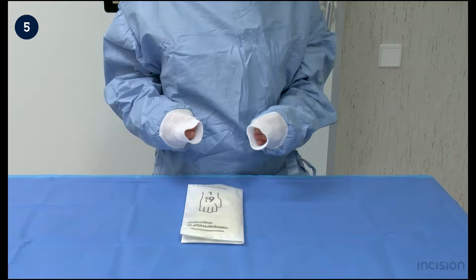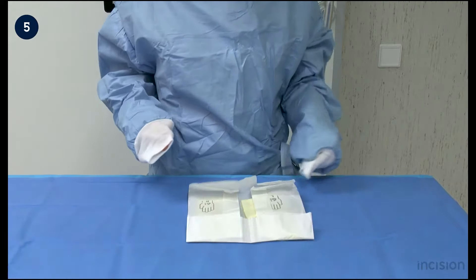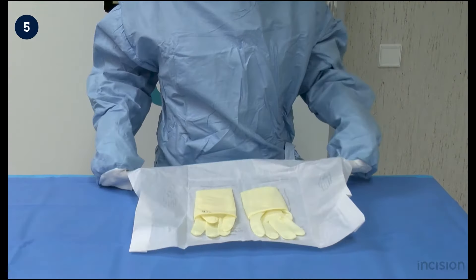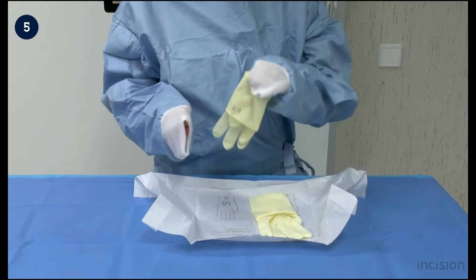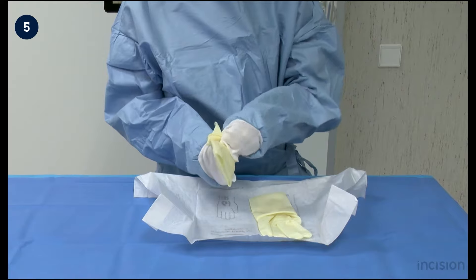With the hands still in the sleeves, the gloves are taken and unpacked. Folding the lower edge of the wrapping paper prevents the paper from folding back. Pick up the right glove with the left hand at the folded border. The folded glove is turned around so that the thumb of the glove is facing downwards.